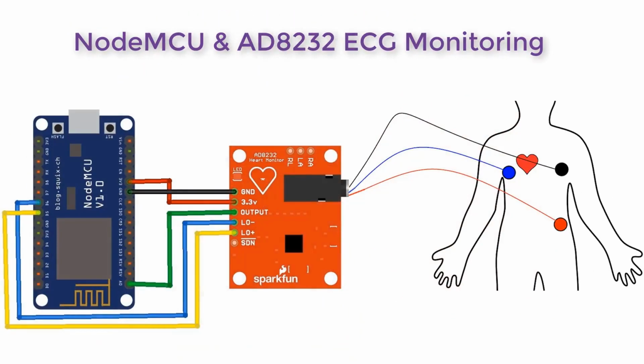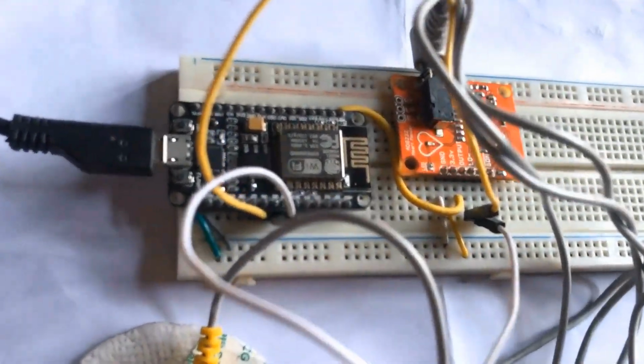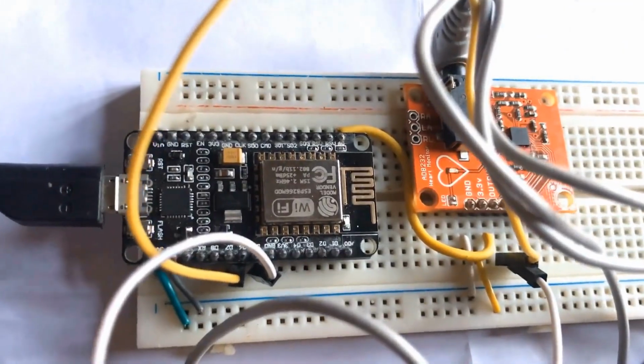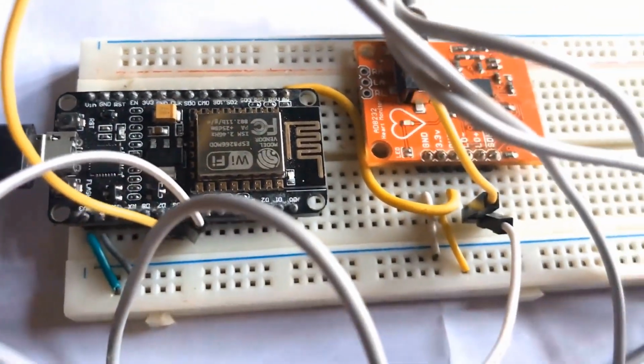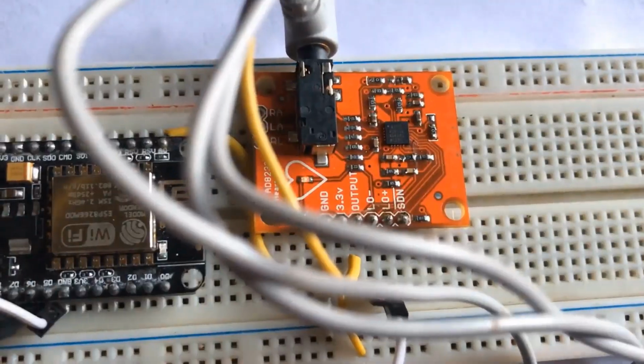So here is a connection of how the ECG leads are placed on a patient's body. So we have RA, LA and RL, that is right arm, left arm and right leg. So you can place it on the chest as well. So here is how we have assembled the AD8232 and NodeMCU on a breadboard. The connection is exactly the same as shown in the figure earlier, that is, the circuit diagram.